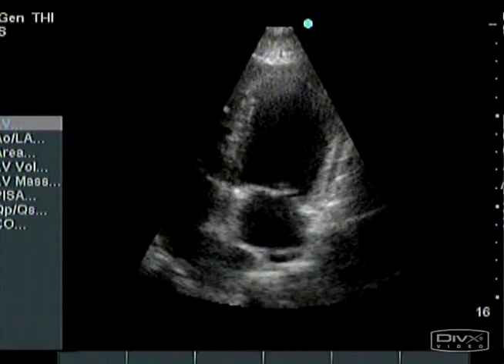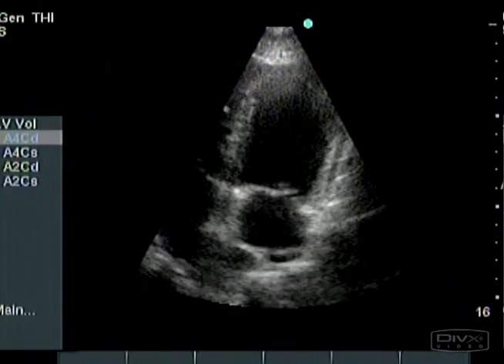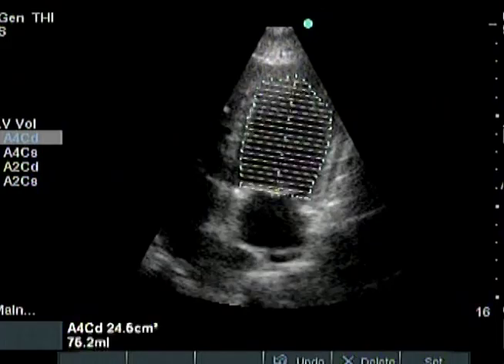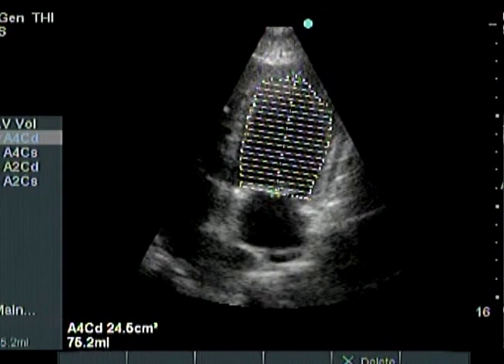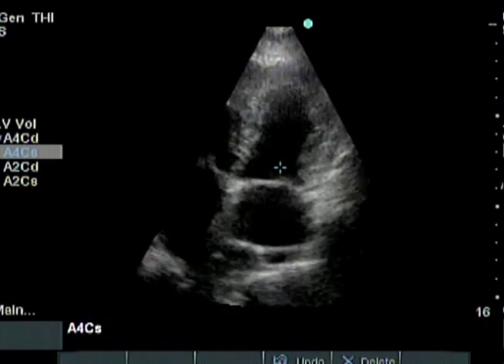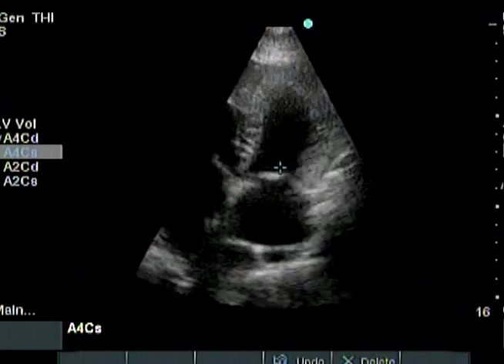This 3-year-old Doberman has a severe pulmonary insufficiency causing a severe right ventricular enlargement. There is also advanced severe mitral insufficiency. Because of paradoxic septal wall motion, left ventricular fractional shortening is low normal at 28%, and ejection fraction is slightly below normal at 56%. A left apical Simpson's rule measurement shows an ejection fraction of 71%.